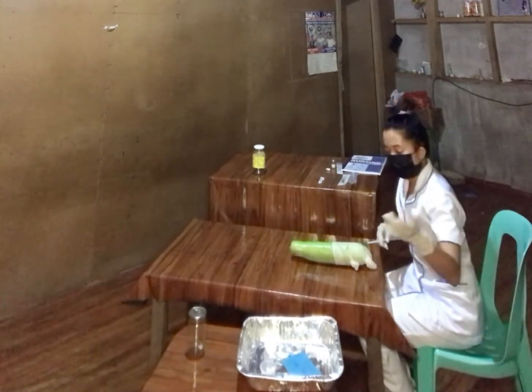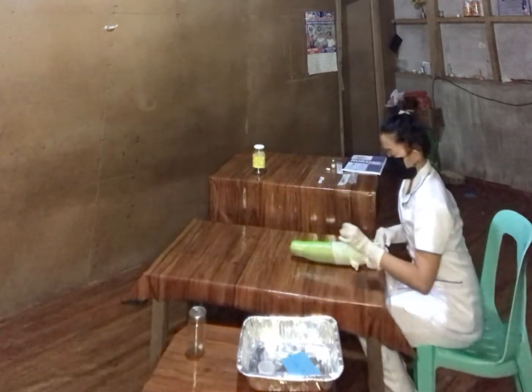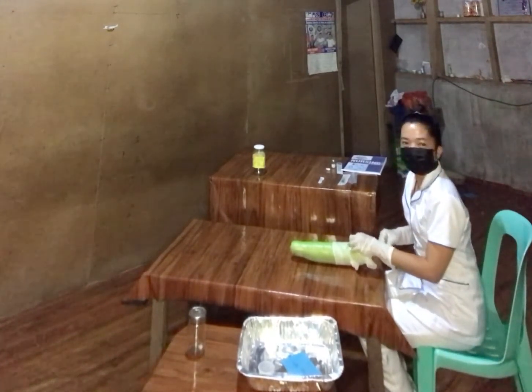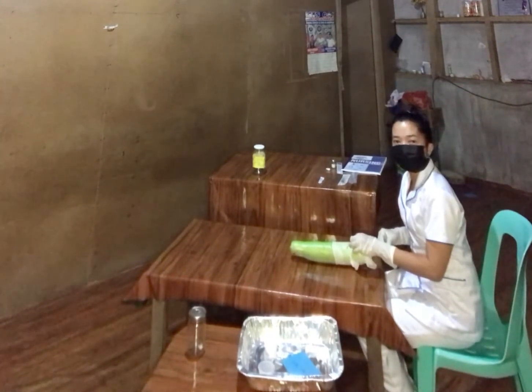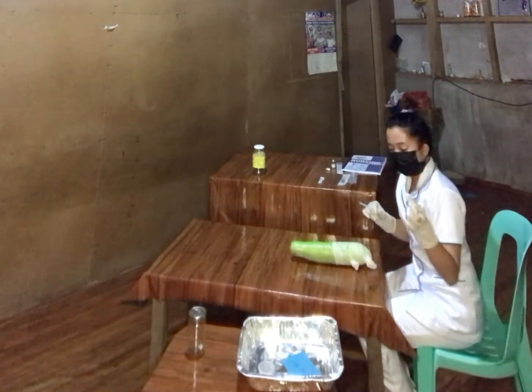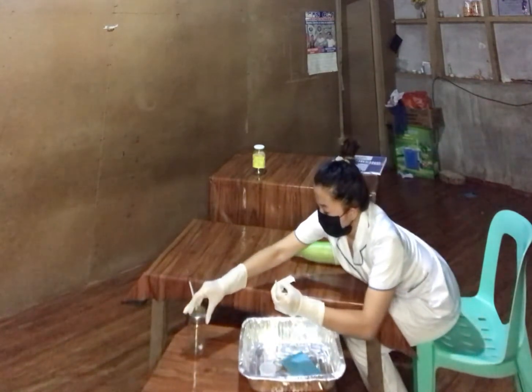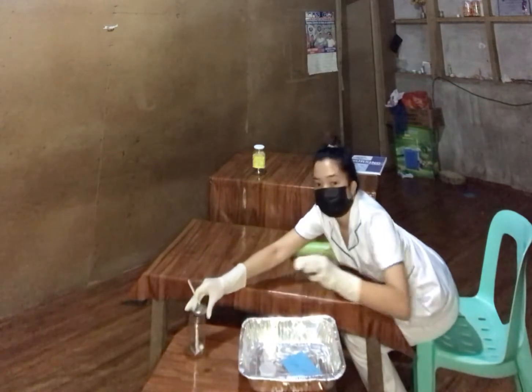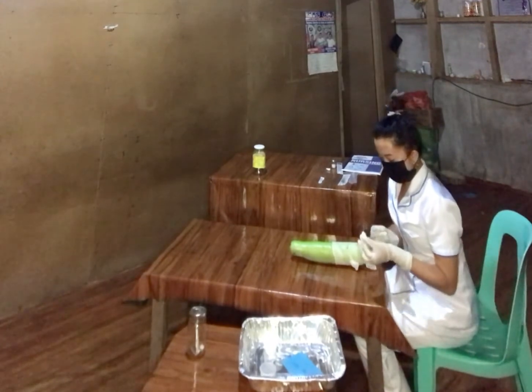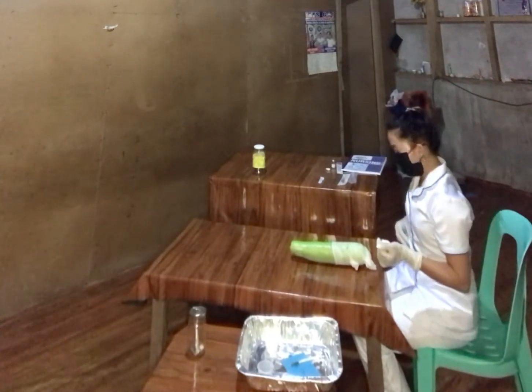And now I will put this cotton, then I will withdraw the needle at the same angle to minimize the tissue damage and discomfort. So I will put this into with this. Now I will going to encircle the site of injection.